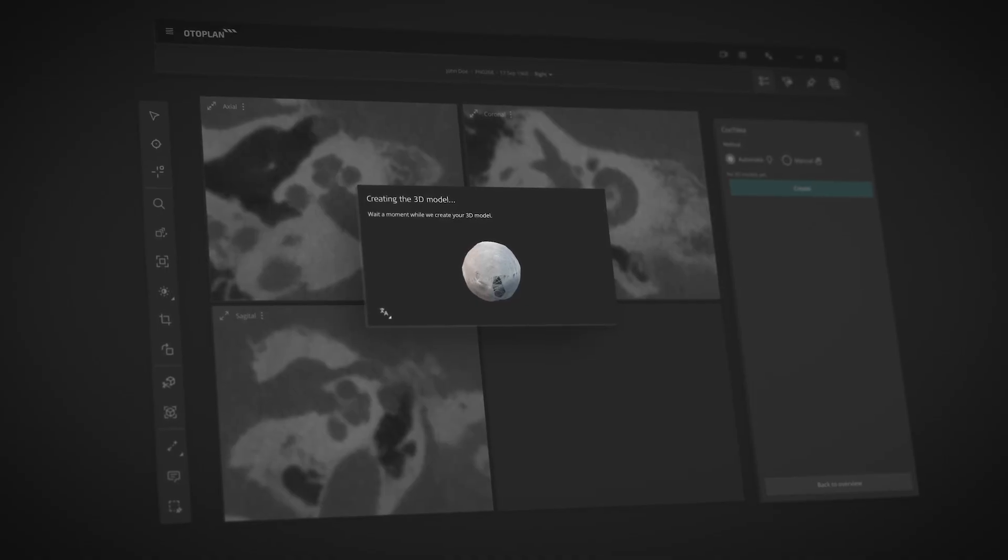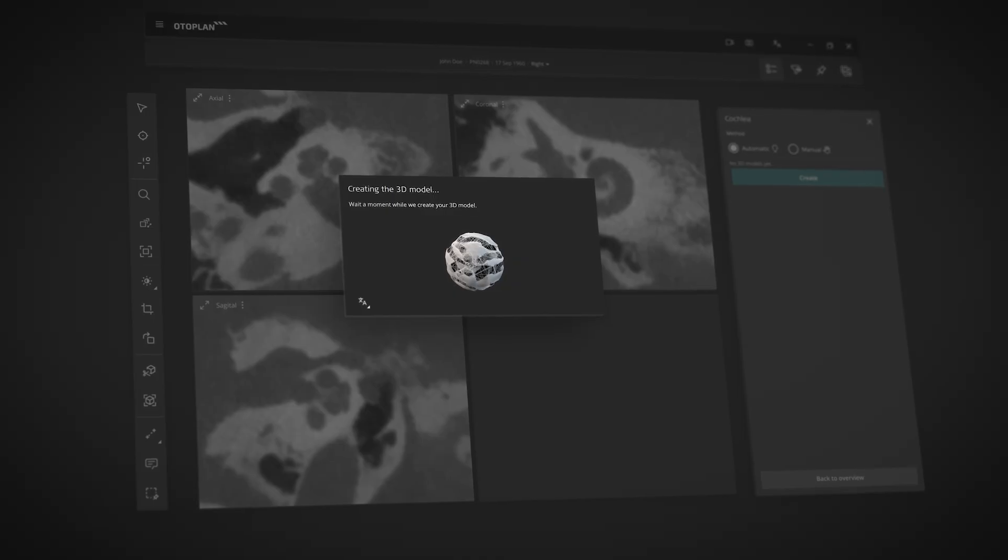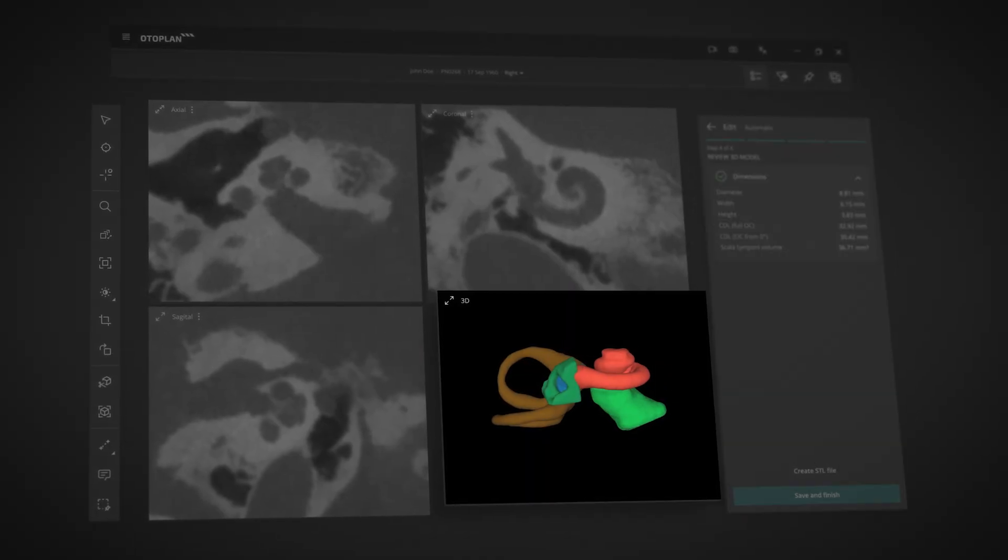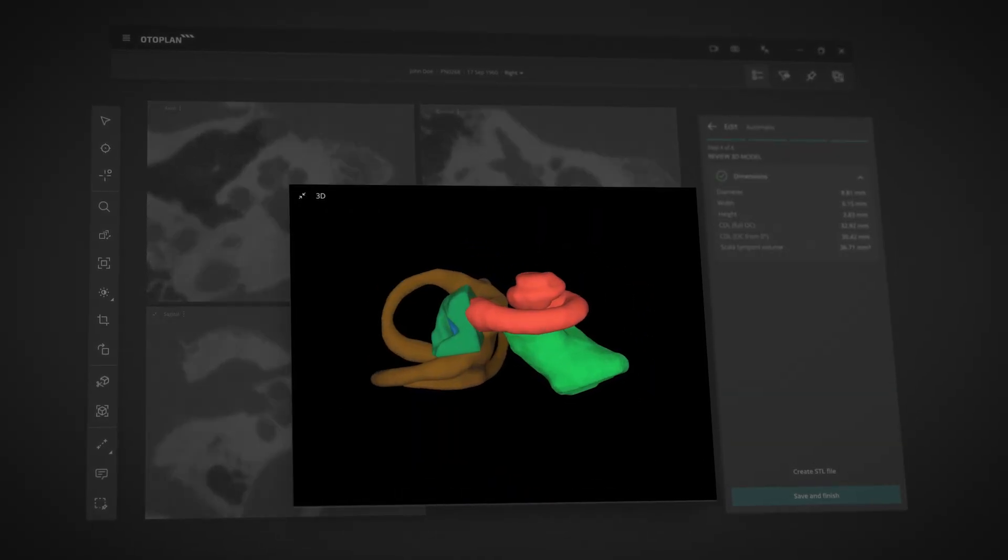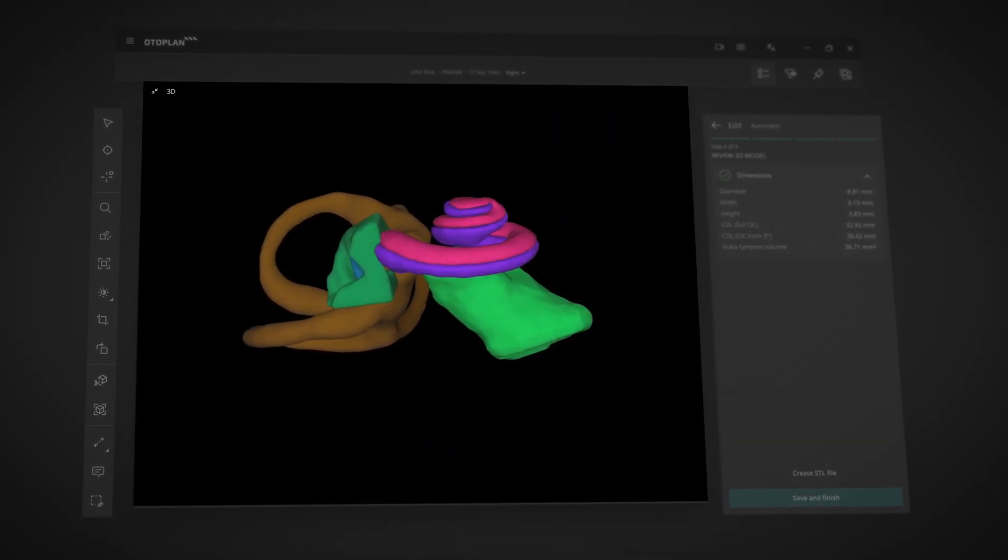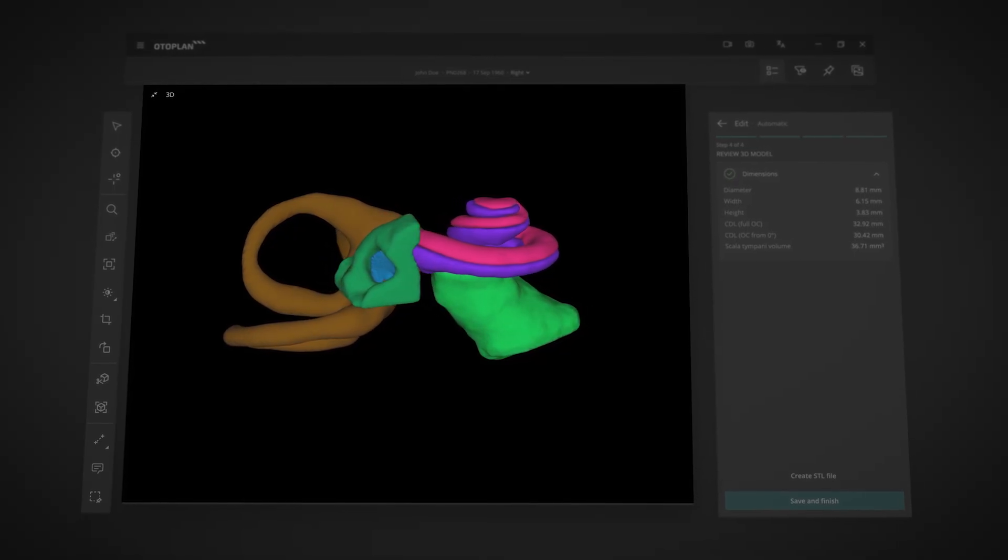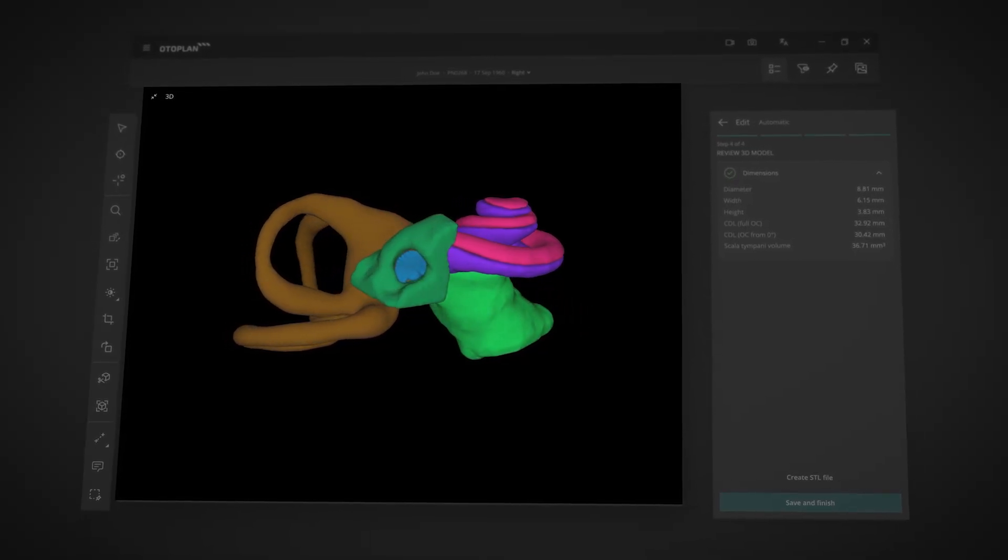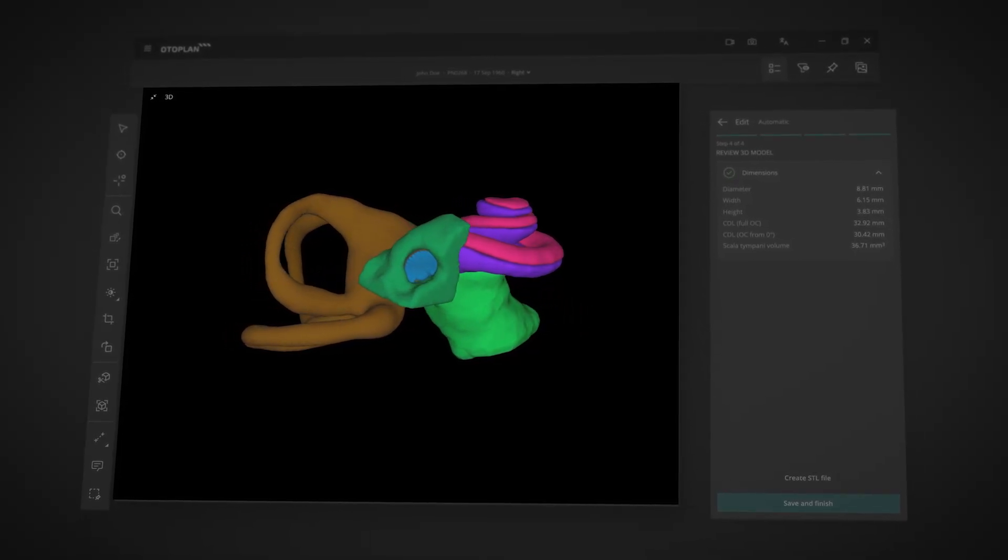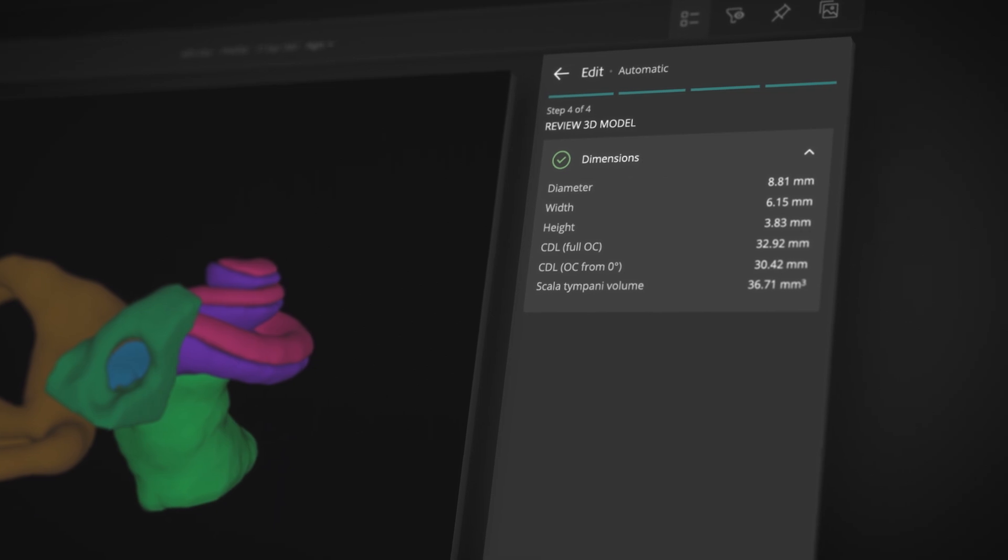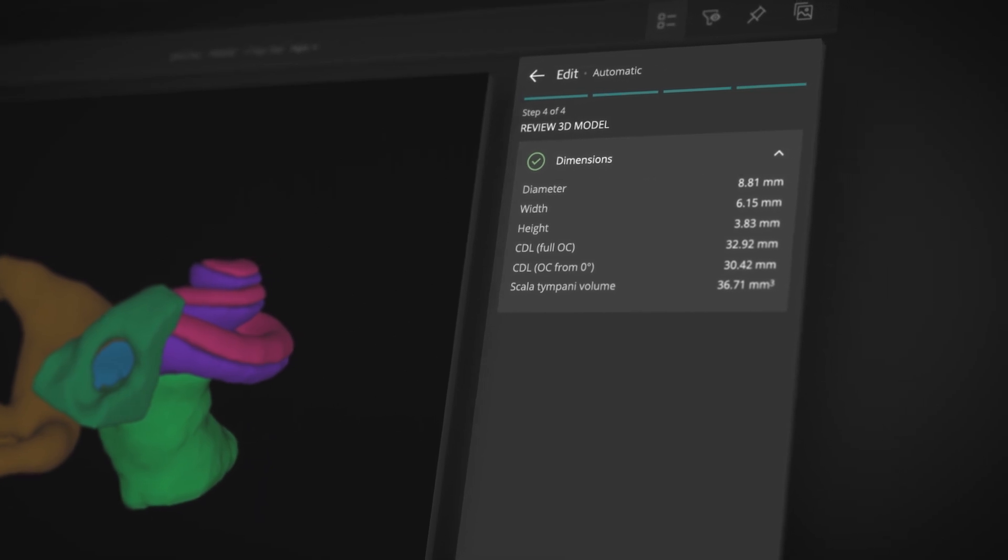Imagine what you can do with detailed visualizations of each patient's unique inner ear anatomy reconstructed automatically in less than 2 minutes. These visualizations include the entire inner ear. OtoPlan even provides automatic cochlear parameters.